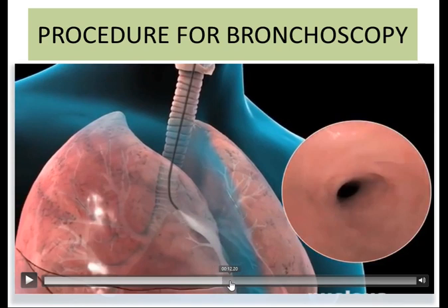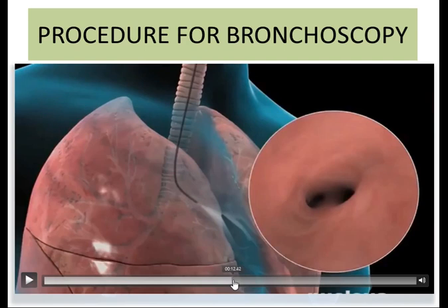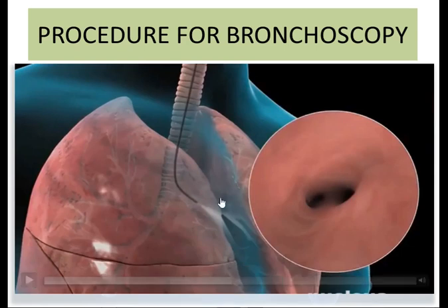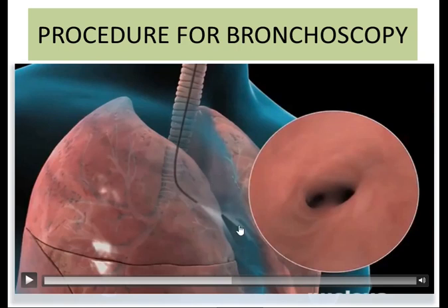We have entered the left lobe. The left lung is now under our bronchoscope. What we can now see is again two openings — this time these openings are of the lobar bronchi. Lobar bronchi means those bronchi which supply the lobes of the lungs. On the left side, we have the superior as well as the inferior lobe, so there will be two lobar bronchi, and being two lobar bronchi, the number of holes is two.